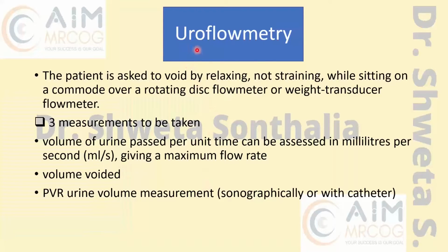Now, as I told you, uroflowmetry is a non-invasive thing. What she has to do is simply void by relaxing, not straining, and sitting on a commode over a rotating disc flow meter. So this is what the women will do, and the measurements you will take will be the volume of urine passed per unit time, which will tell you the flow rate, milliliter per second.